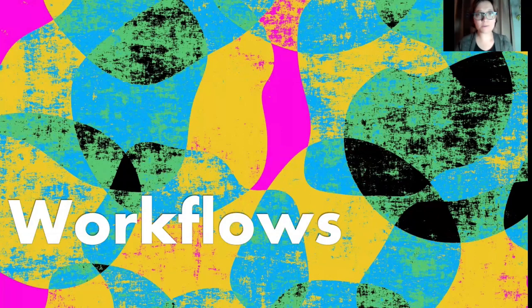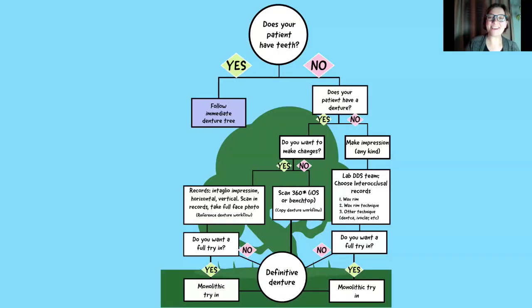I'm going to touch on just a few basic workflows, some of the highlight reel to tease you for the next webinar. And when you look at digital dentures, there's so many different ways you can go. So something that I've been working on is trying to create some flow charts and resources for my dental students and anybody else that's interested to kind of help make sense of where to go next. And so this is a decision tree that we've been working on with where do you go when your patient comes in?